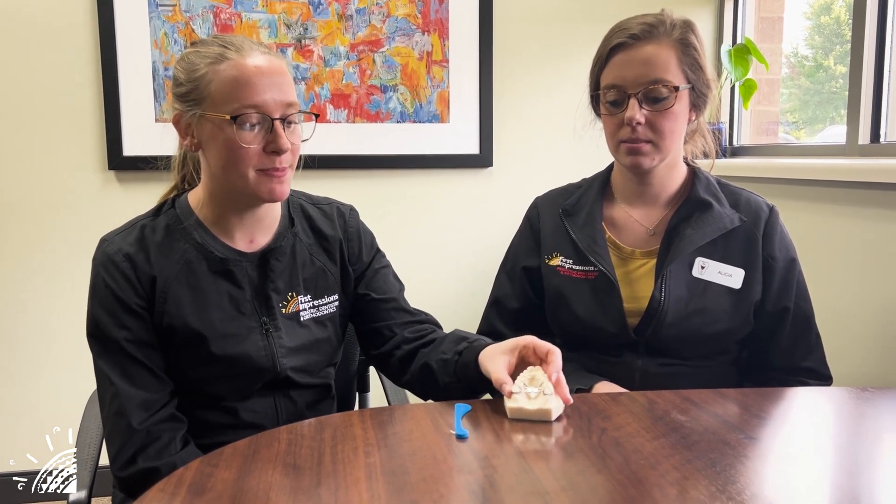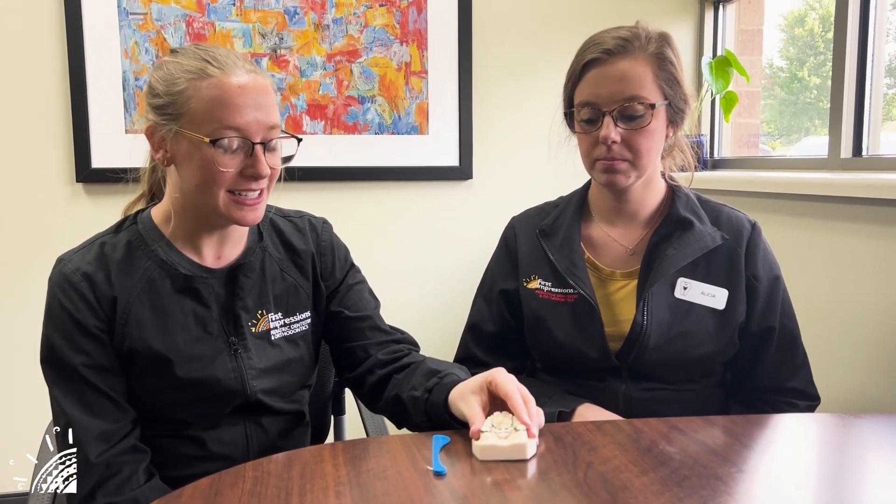All right, so today you or your child may have had this RPE, a rapid palatal expander, placed. We're just going to go over some instructions that we likely went over with you already today.